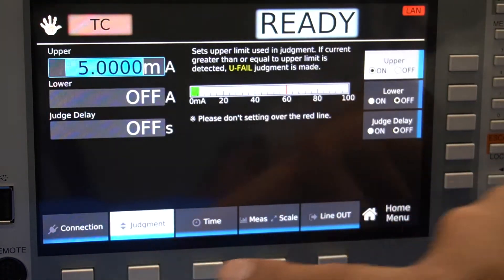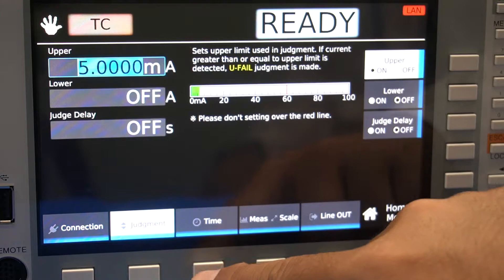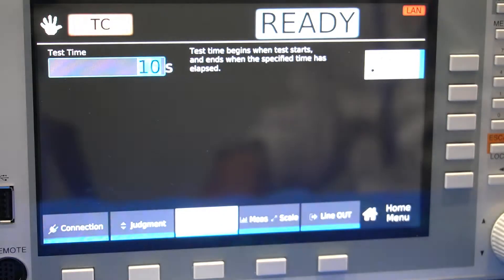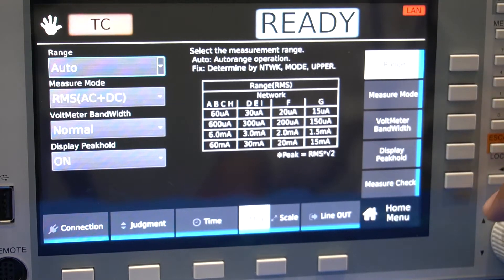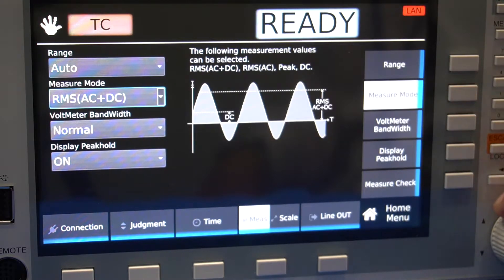First, set the upper limit current. For this test, we will apply 5 milliamps. Then, set the test time by turning the knob or inputting it with the number keys. Here, we set it for 5 seconds. Make sure the line-out is set to off — if it is set to on, you will not be able to initiate the test.